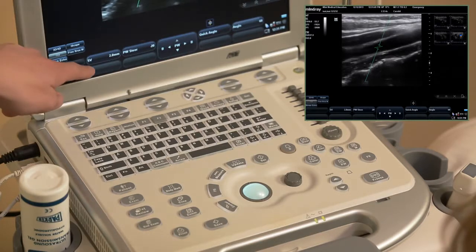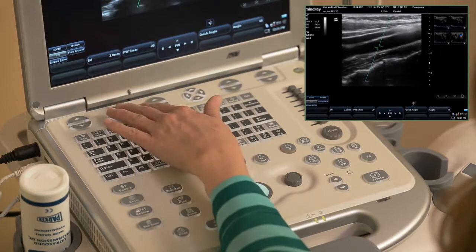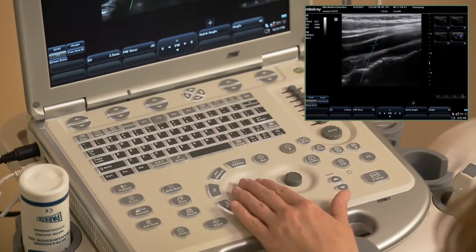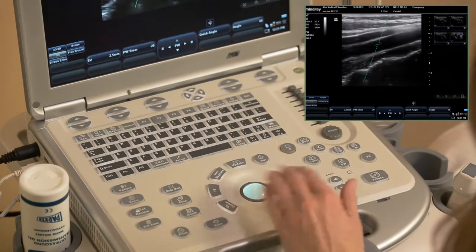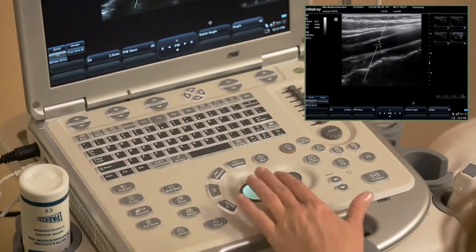When you use the soft keys or use the trackball and the set key, there are 3 ways to do it. But if I try to use the trackball, it's moving here, so maybe it's because I got it started already? Again, that's where the cursor button will come in handy.